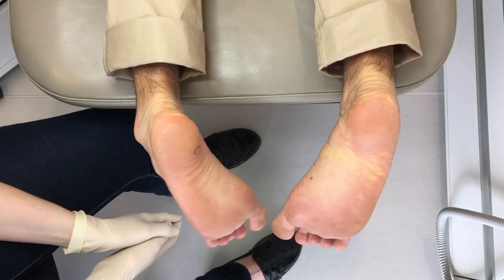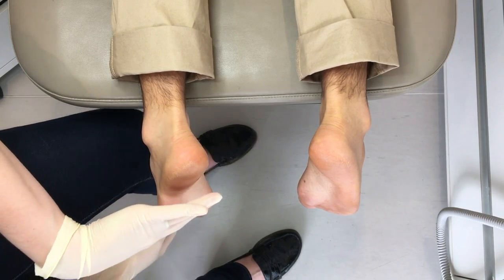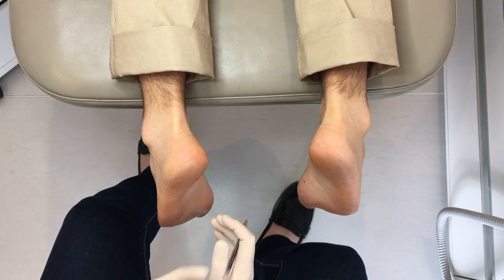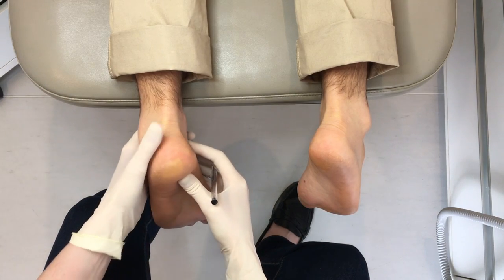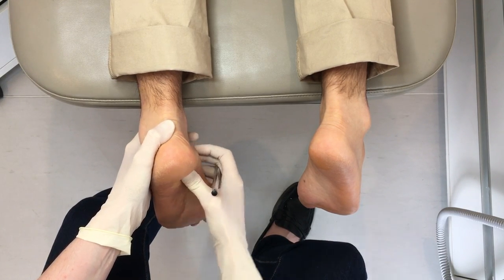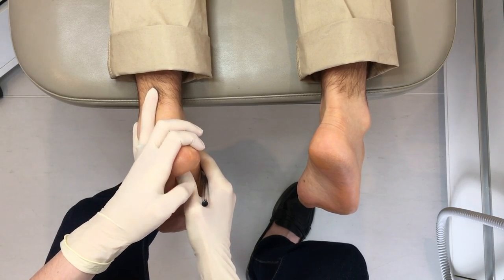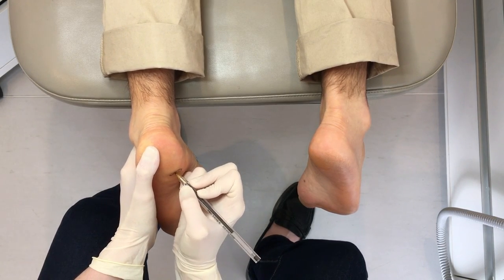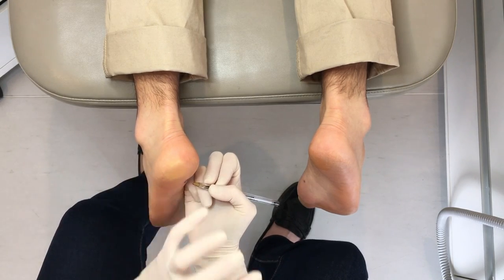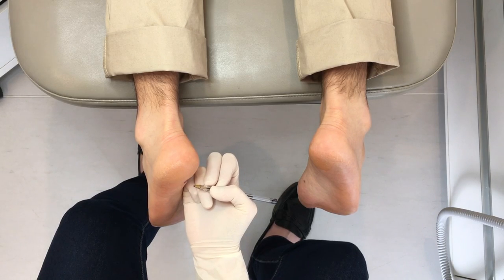Kevin's been nice enough to let me demonstrate on him today. We're going to pretend that Kevin has plantar fasciitis or heel pain. What we do is find the area where there's the most pain and that's where we'll be delivering the sound waves or pulses. I push around the site to find the spot where it's most painful, draw on that area, and that's where I'll be delivering the sound pulses. Sometimes it's more than one spot — we split the pulses between areas — but it tends to be one or at most two areas.